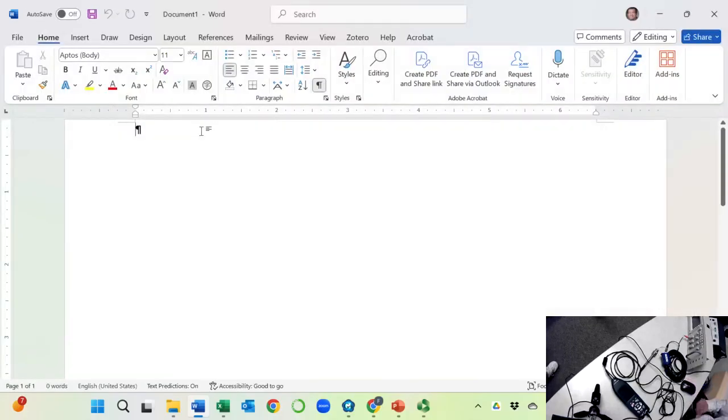Okay, and here I'm going to use a Word document, and let's see. Let's say the expected frequency is 1000 hertz. Again, we expect the audiometer to produce 1000 hertz.